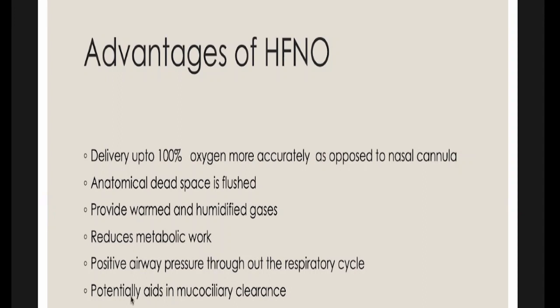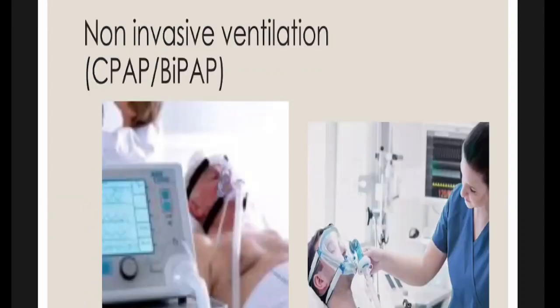And also it potentially aids the mucociliary clearance, which is a good thing, as the mucociliary escalator should work to clear the germs and the bacteria, isn't it? So from the high flow we'll move on to another mode of non-invasive ventilation, which is known as CPAP or BiPAP.